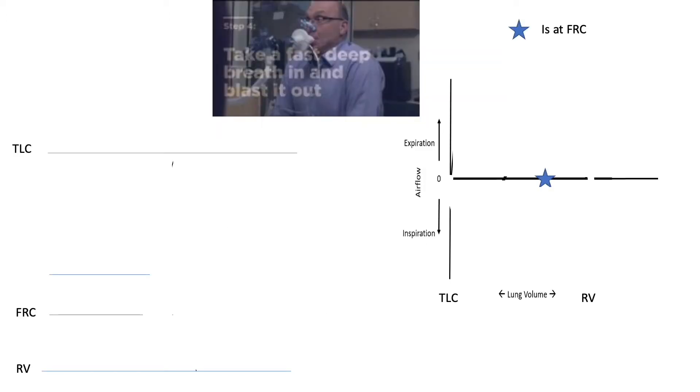This slide is a little busy, but I'm pretty proud of it. It explains how spirometry is performed and how it translates into the lung volumes and the flow volume loop. The video on top is something that you'll be able to look up online. It's publicly available on YouTube and was posted by the National Heart, Lung, and Blood Institute of Dr. Antonello Punturieri demonstrating how to perform the technique of spirometry. You'll be able to hear the instructions on this video.